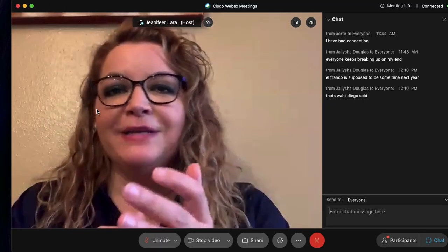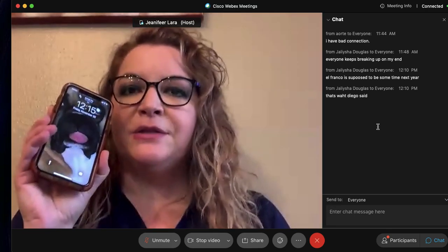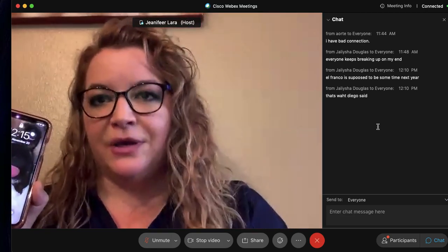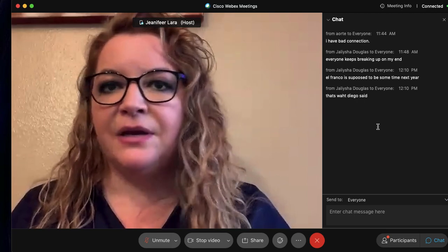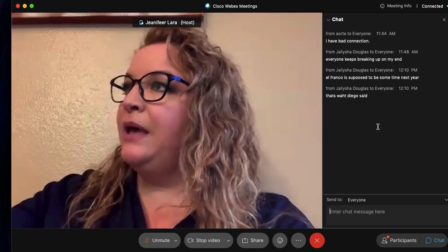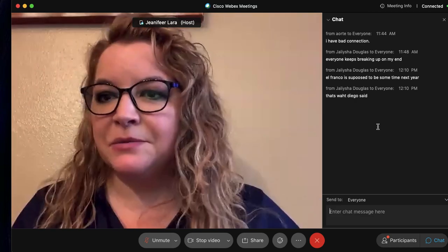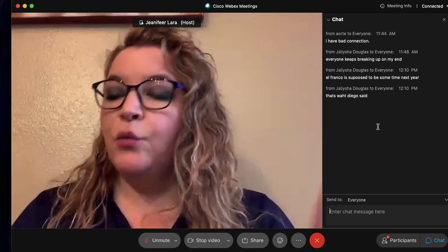Post-processing is how we manipulate the manifested image. It is how you go back to your images and you apply those little filters. You're like, ooh, I got acne, let me take that off. Ooh, I got a wrinkle right here, let me take that off. It is a way of altering what you have stored electronically. That is all post-processing does, right? When you go out to the clinics and they go back and they post-collimate, that's post-processing. They're just taking the manifested image and altering the pixels on that matrix, on that monitor. Make sense? Good. Perfect.